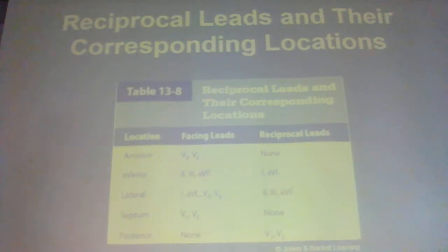So I have this patient that's presenting like an acute coronary syndrome. I do not have any ST elevation anywhere, but I have significant ST depression in V2 and 3. That's my clue. I'm going to go around to the back and look. So I'm going to do a V7, 8, and 9. Okay? Does everybody remember how to do that?